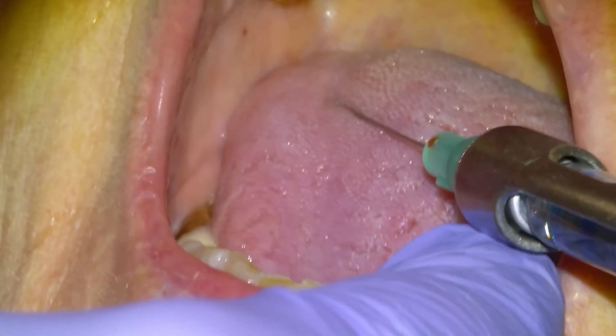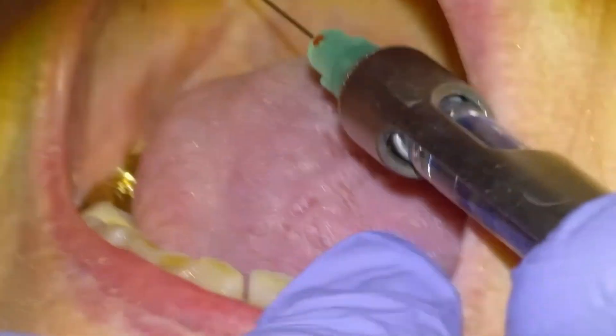Articaine for a block is kind of like using a cheat code — it's just nearly 100% accurate. If you use Articaine and you're also aiming higher at the level of the maxillary plane, it's going to land and they're going to get very numb — probably for a very long time. Another challenge with blocks is the tongue. It can really get in the way, especially with people whose tongues fill a lot of space, and if they're reclined the tongue can fall back. If you ask someone to relax their tongue it just goes everywhere.